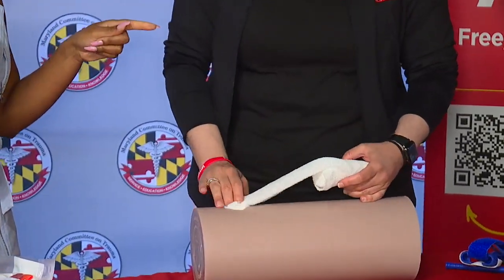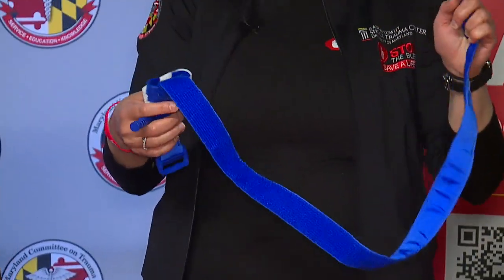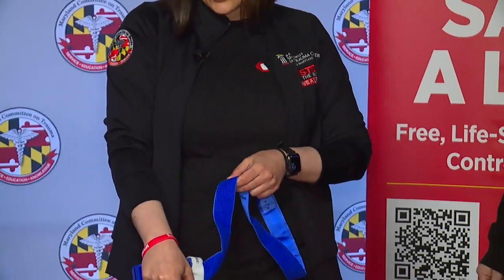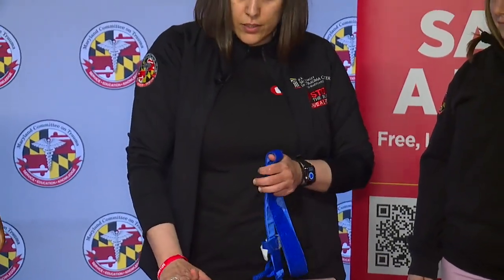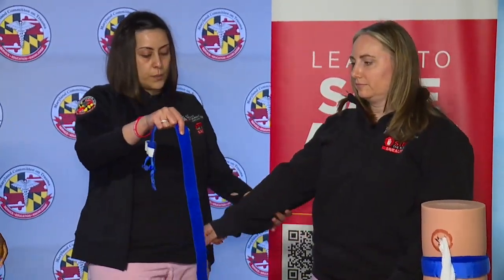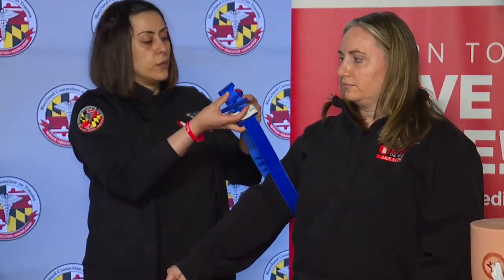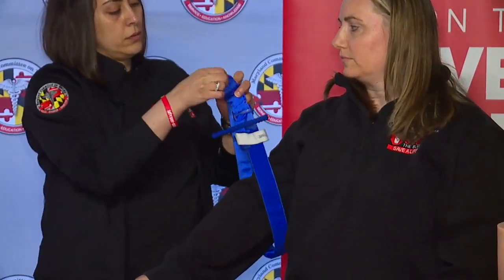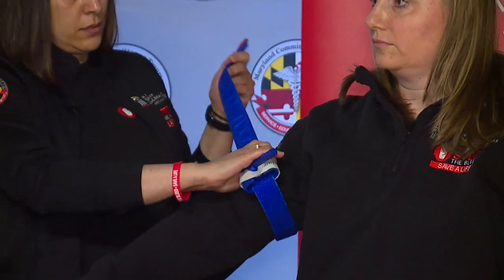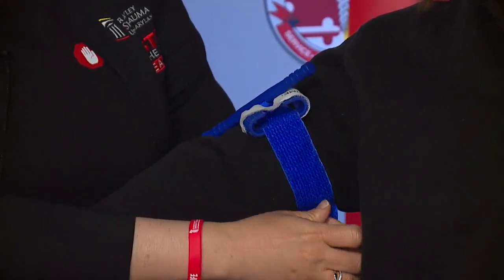Exactly. And now also we want to demonstrate what do we have here? A tourniquet. So for wounds that are a little deeper and you can't actually control the bleeding with simply packing with gauze and holding pressure, one thing that you can use is a tourniquet. And so you would want to put the tourniquet basically above the area where the wound is, and you want to pass it through. And how long can something like this last before first responders get to the scene? Actually for multiple hours. Okay, wow.